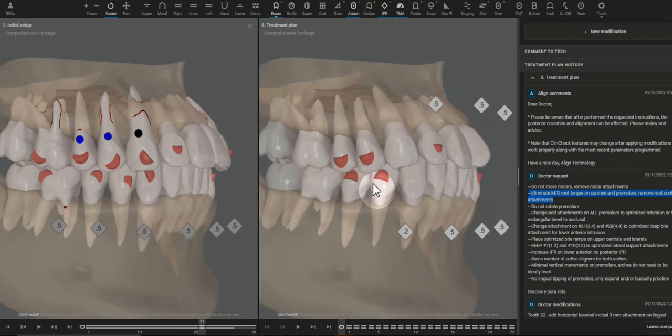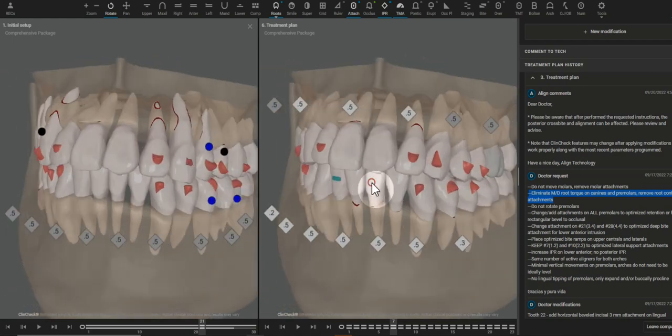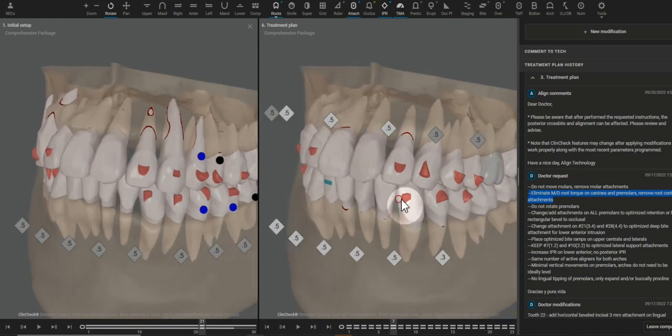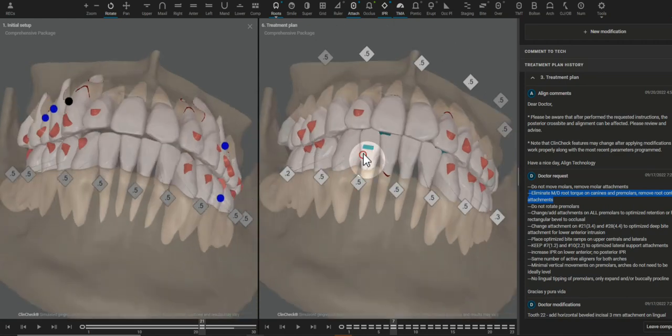Once that movement is eliminated, we can utilize the attachments on the premolars in a better way by placing retention attachments. Retention is different than anchorage, but this is meant for the aligner to be well retained on the arch. When the aligner is fitting really well onto the arch, every other movement that we want to do, like rotation of the centrals for example, is going to be more predictable.